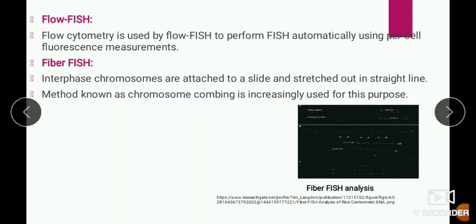The expanded conformation of chromosomes helps in higher resolution, and the construction of fiber FISH samples is performed routinely in specialized laboratories. So this method is not possible in common or general labs.